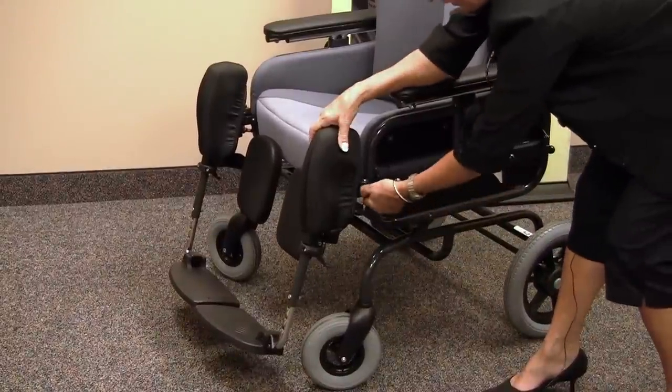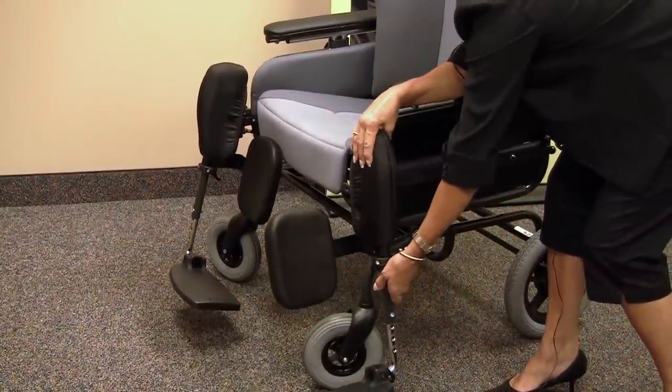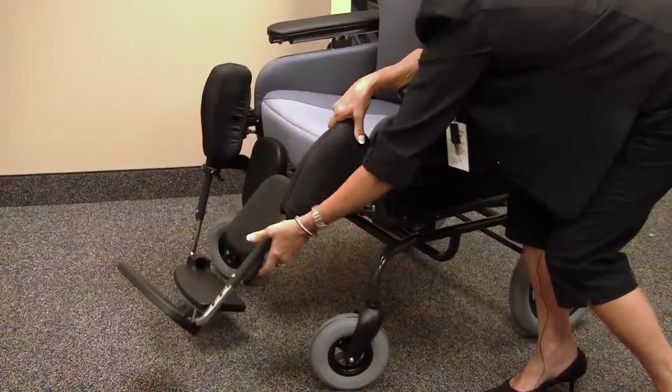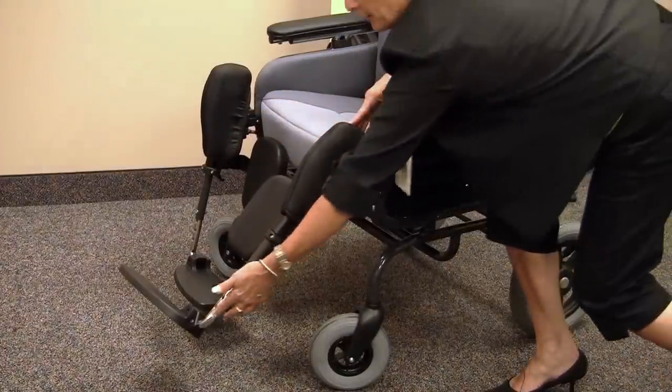The Judy chair also offers swing-away, removable leg rests that elevate. They offer a padded calf pad, lateral knee pad, and are adjustable in length.